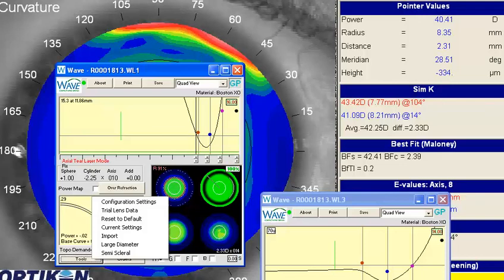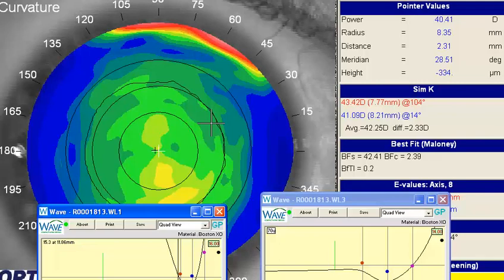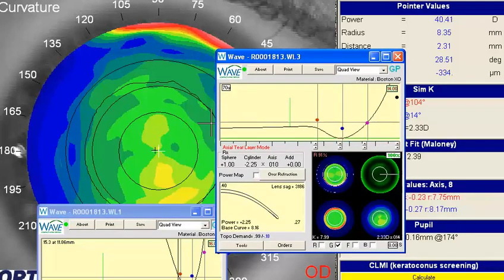The other thought is when you look at that smaller diameter lens, if this lens was acceptable, you may even just look at this peripheral curve on this lens, because this looks like a rather steep edge angle. If there are some adjustments that you can make, whether moving the pink ball up or down, or the black, to adjust that edge angle, you might be able to reduce some of this patient's feeling like the lenses are dirty throughout the daytime.